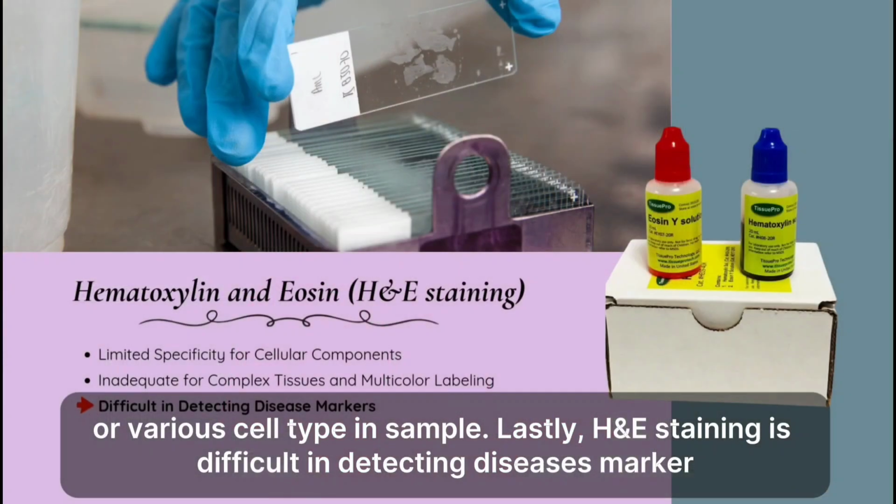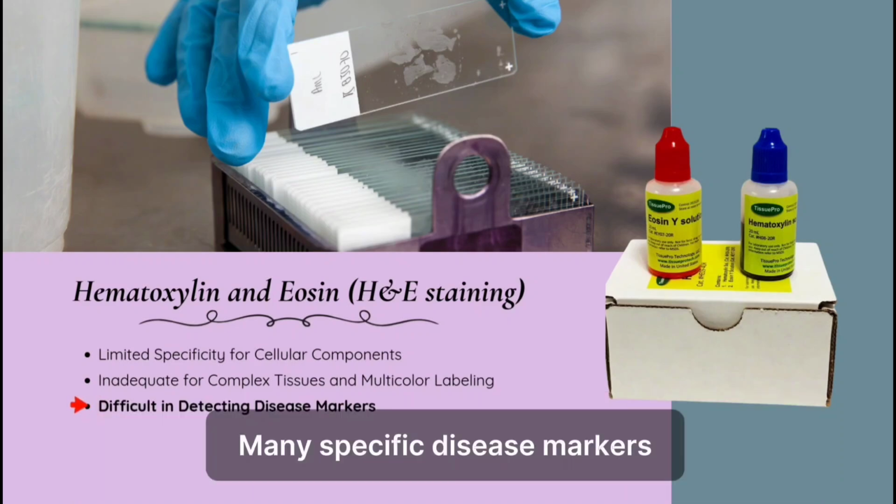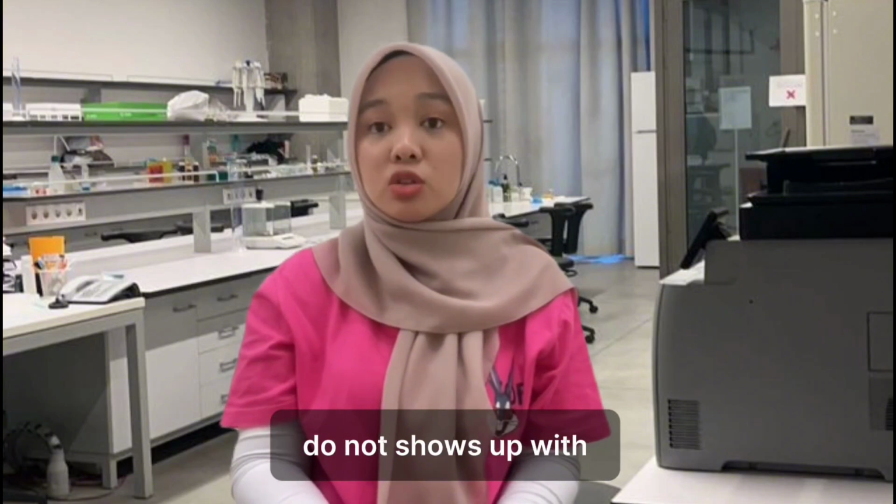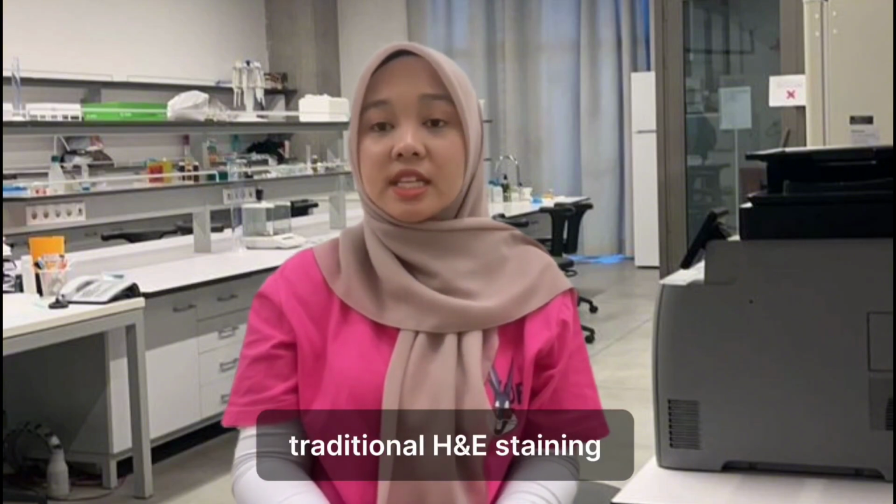Lastly, H&E staining is difficult in detecting disease markers. Many specific disease markers, such as certain proteins or genetic markers, do not show up with H&E staining.